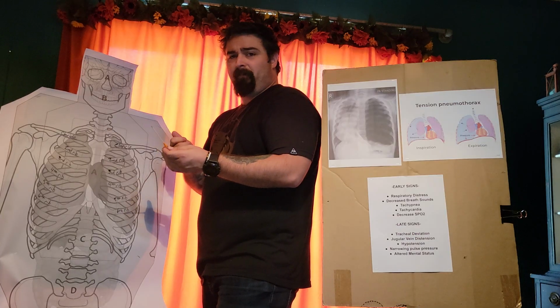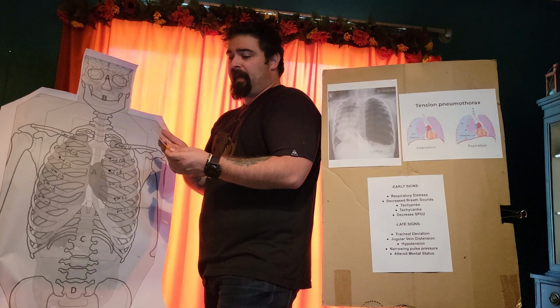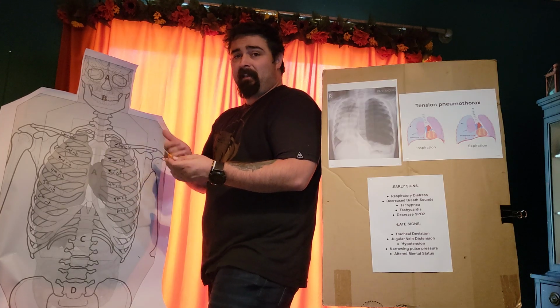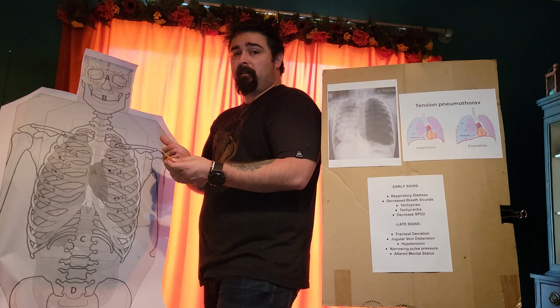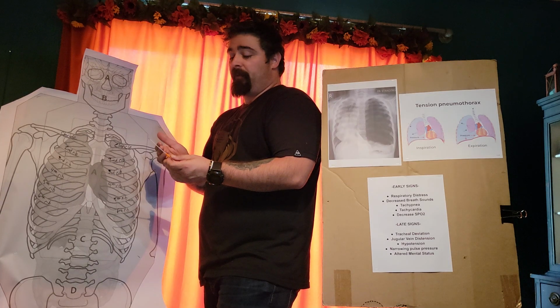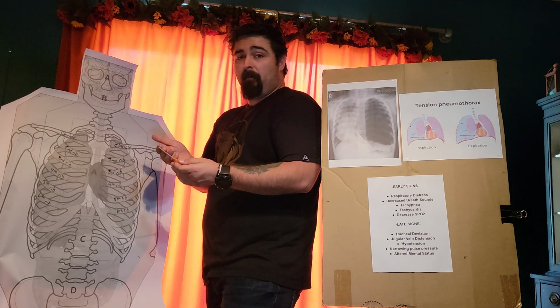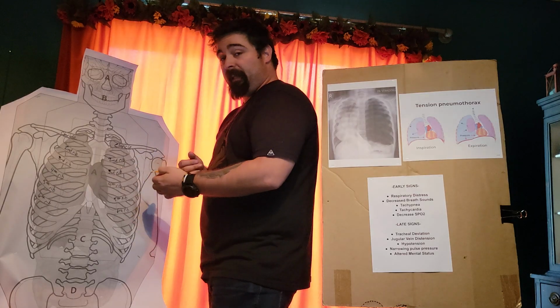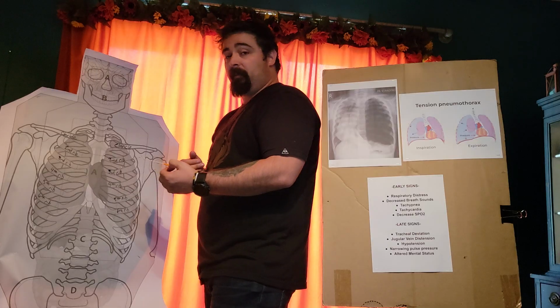You can use a flush or a syringe to push any adipose fat, or muscle or blood, anything that may have clogged up that catheter. And assuming that it's not kinked or sheared in any way, you can now replace that into the site.